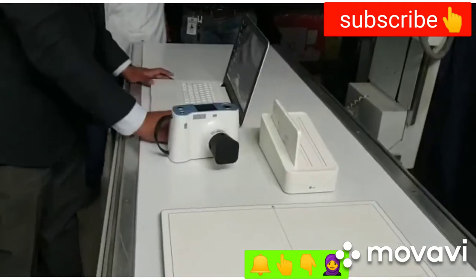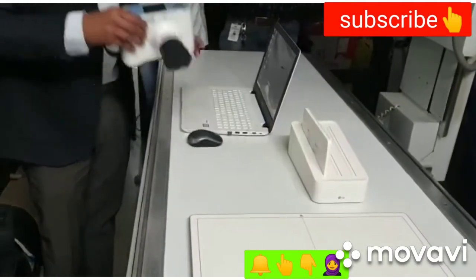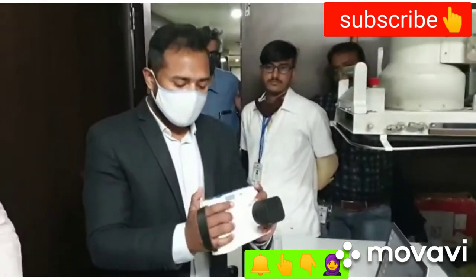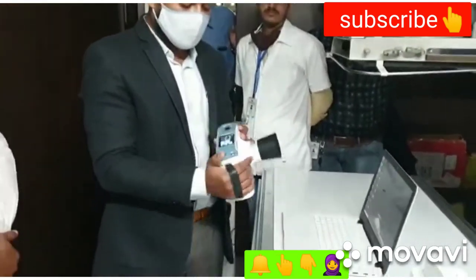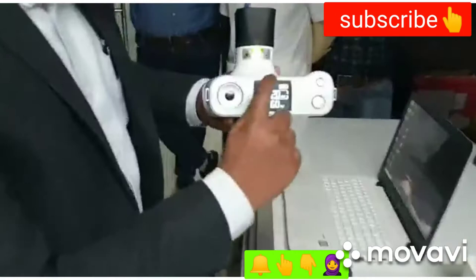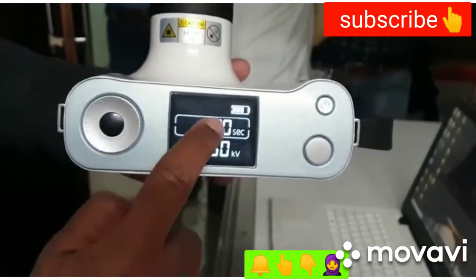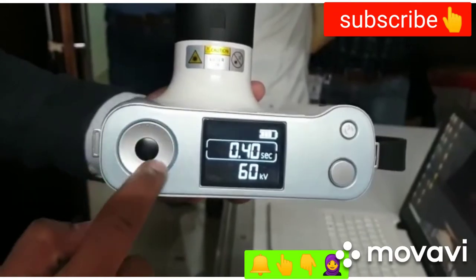The weight of the X-ray machine is 1.8 kg — you can easily lift it. This is how you put it. Once it turns on, this is the GUI interface on top — it shows the battery status, and this is the timer dial.